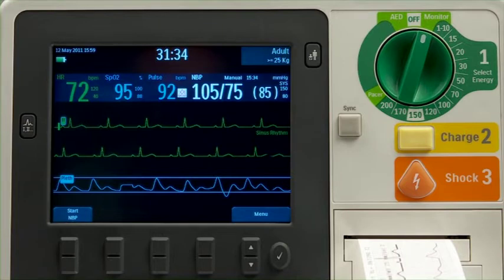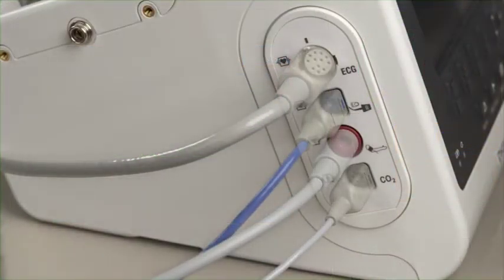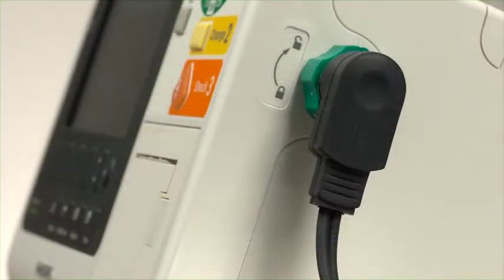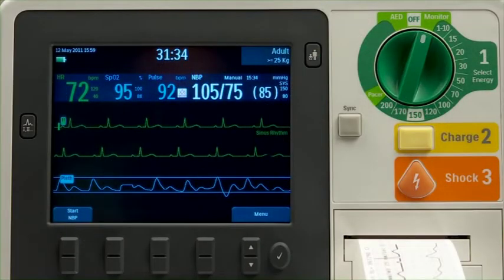The XL Plus controls and connections are carefully organized to facilitate ease of use. Color-coded ports for monitoring cable connections are on the left — ECG, SpO2, non-invasive blood pressure, and CO2 sensor cables plug in here. The HeartStart XL Plus comes with cable wraps to assist in cable management. A therapy port for paddles or multi-function electrode pads is on the other side. Operating controls and indicators are on the front.